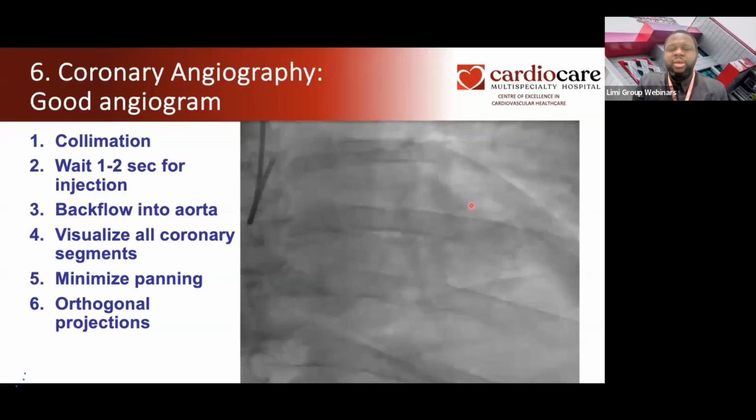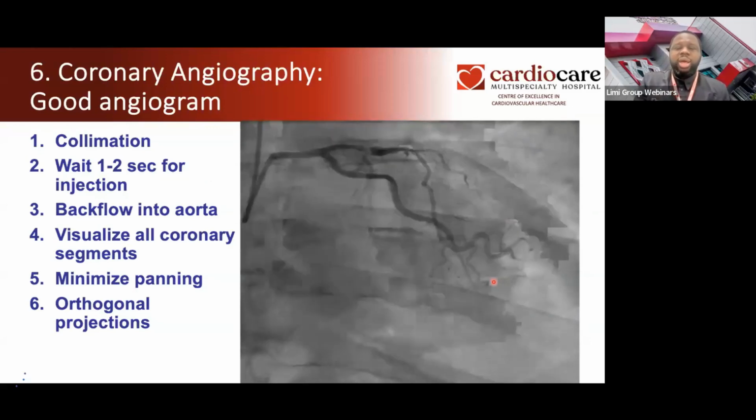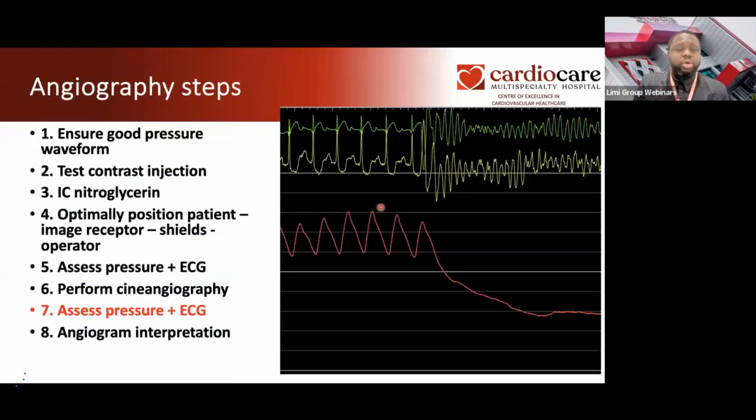Make sure you can see all the coronary segments up to the distal region, and that you have very good projections. We don't want to be moving around too much. After you've done that, please look at the pressure again.